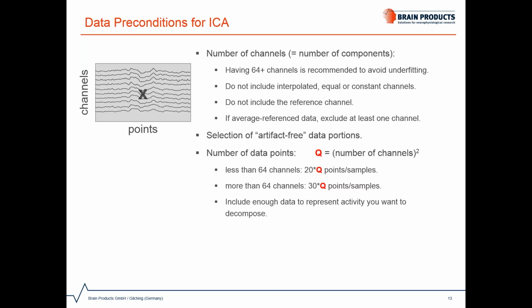This is of course only the minimum that is required, and we would always recommend using more data so that you can adequately represent the activity that you want to decompose. So use something that is representative.